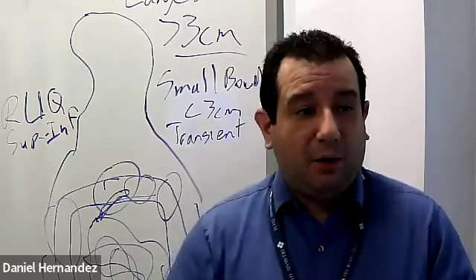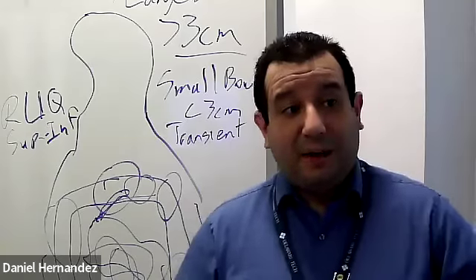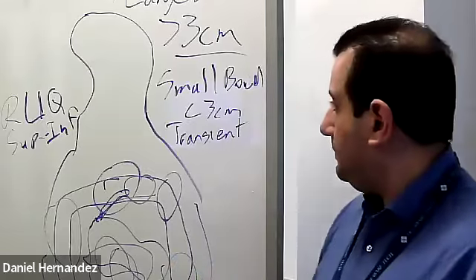Another term you might see on board exams is a pseudokidney or sandwich sign or sandwich appearance. So this is when you turn to long axis on that intussusception.